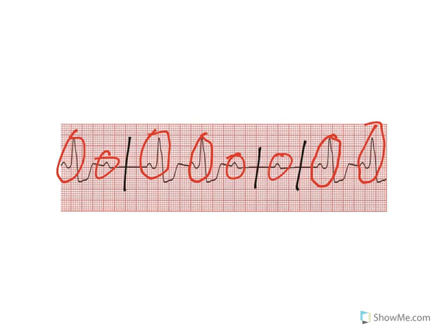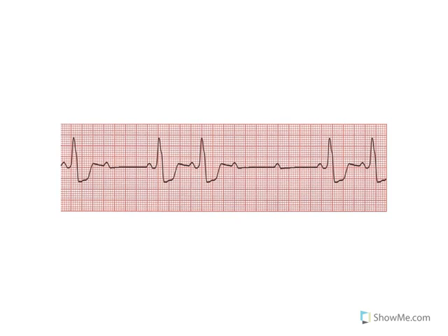When you have these little P waves just sitting out there doing nothing all by themselves. Right? So we have a nice PR interval here, a nice PR interval here, nice and consistent. You can see that the PR interval does not change or only has a very, very small variance that you couldn't even really measure because it would be less than one small box. But then the real telltale sign is these P waves just sitting out here all by themselves.